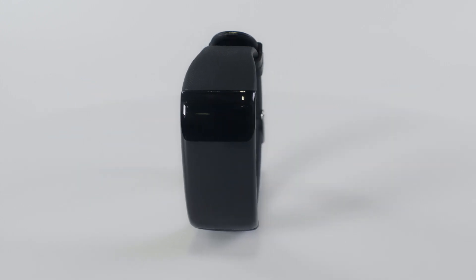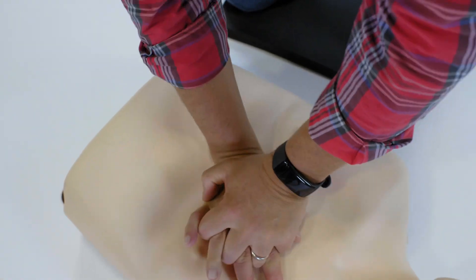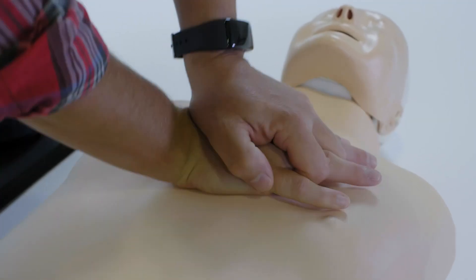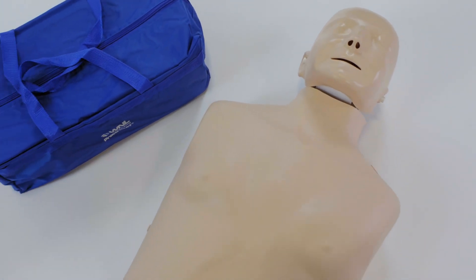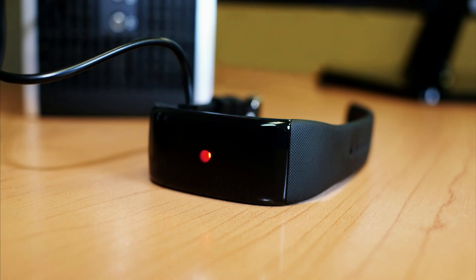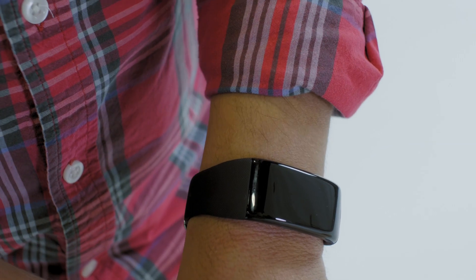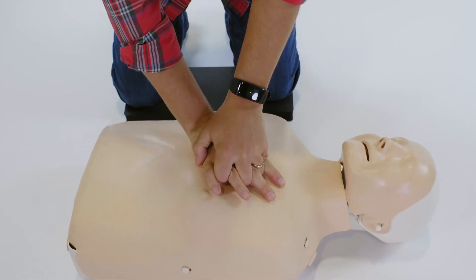The Practice CRDM Compression Rate and Depth Monitor is designed to measure compression rate and depth when practicing CPR on a mannequin. It provides an affordable solution when used in conjunction with mannequins lacking built-in rate and/or depth monitoring, complying with AHA mannequin feedback requirements at a fraction of the cost of upgrading or buying new mannequins.